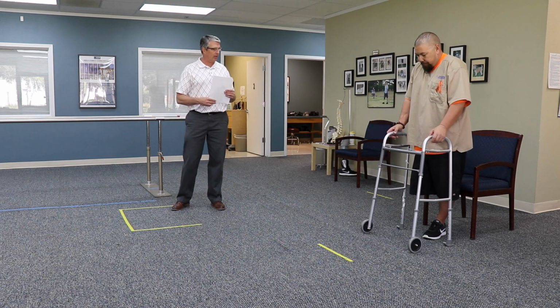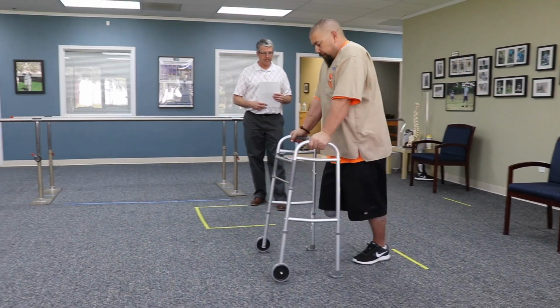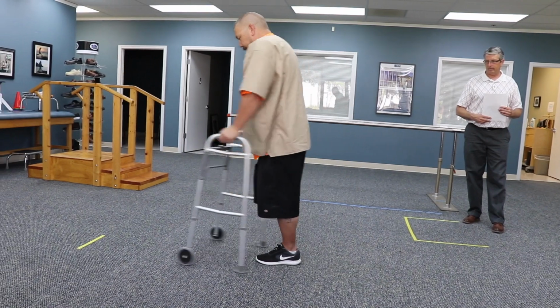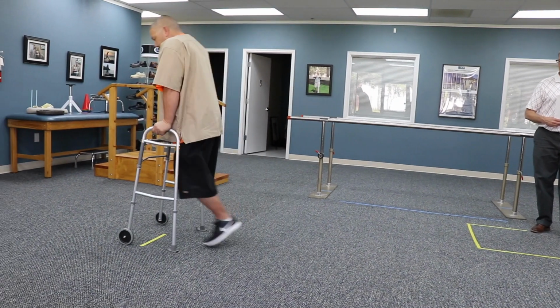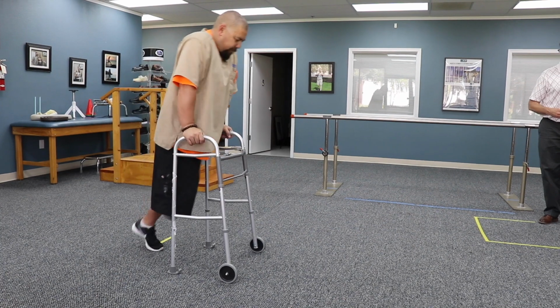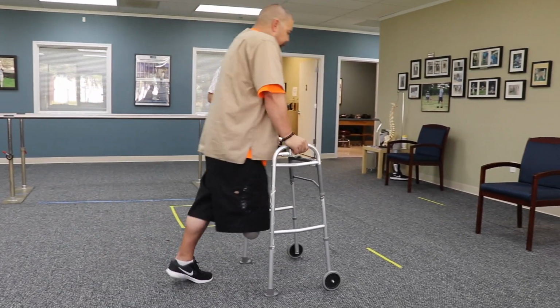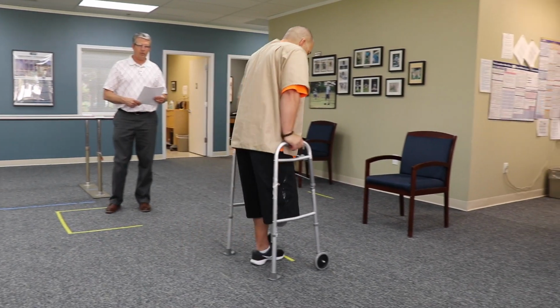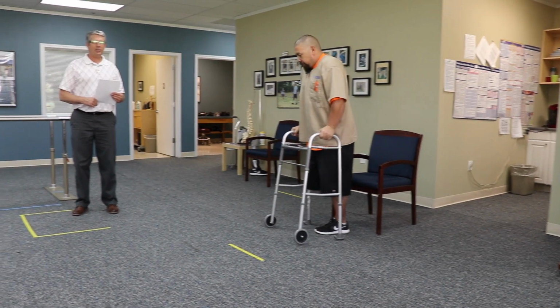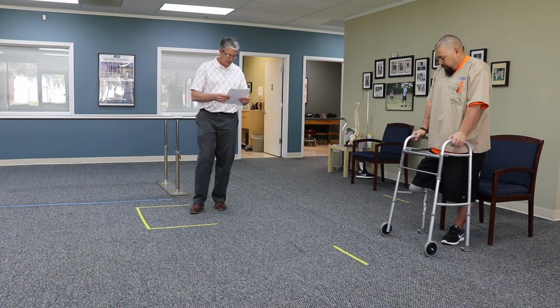Okay, so if somebody can't do their variation, they just have one speed the whole way. Let's see that real quick. Just go short. Speed up. Okay, come on back. Okay. We got one speed. Unable to vary his cadence in this situation, so that would knock him down.